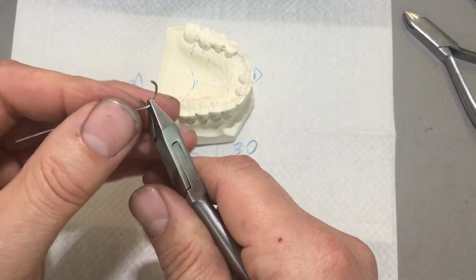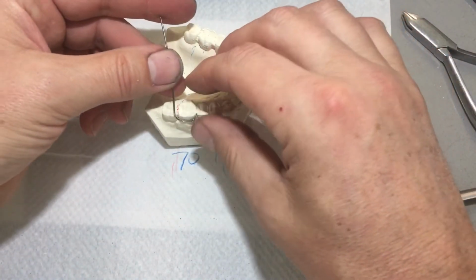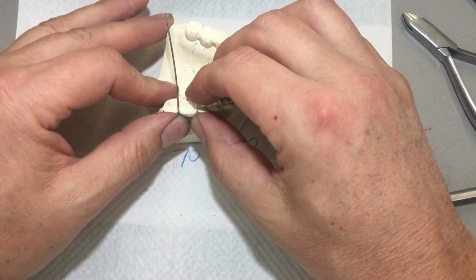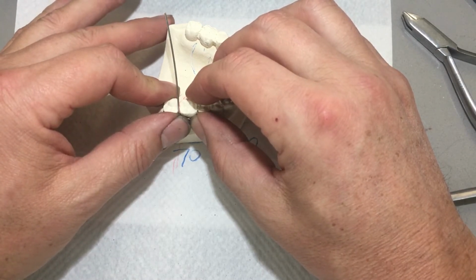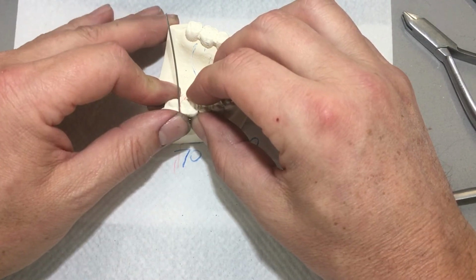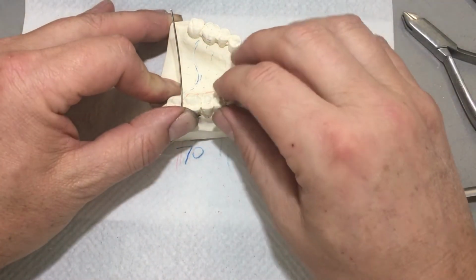Now, unfortunate for dental technology, and here's another thing that we got to arm ourselves with. If I've successfully bent 10,000 wires in a row, unfortunately, you're only as good as the last one you've bent. So my whole career is riding on this wire right now. That's heavy. You could be a pilot, successfully fly the plane for 40 years, and then you crash, kill everyone on board. And then you are deemed as a lousy pilot. Would you not agree? Even though you successfully taken off, landed, I've flown around the world a bazillion hours.